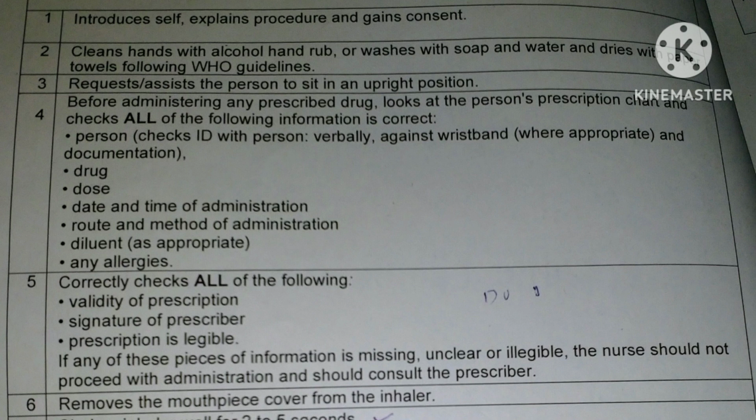Then how to start? The patient is already sitting in the upright position, so we take, for example, a Ventolin inhaler. We cross-check with the prescription chart, the expiry date of the medication is checked, and the prescribed dose and the available dose are checked. Everything is clear. Then we remove the mouthpiece cover from the inhaler. It's very important. If you forget to remove it before shaking, you will fail the exam. I have an example: one of my friends failed only for this minute mistake.